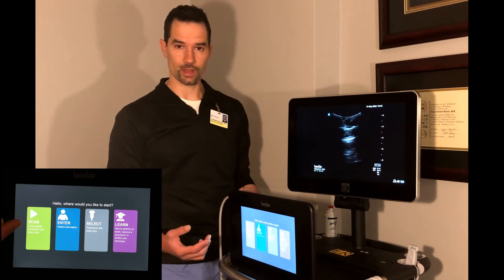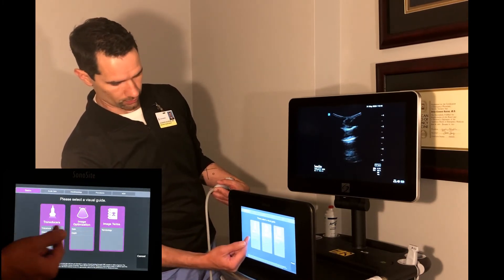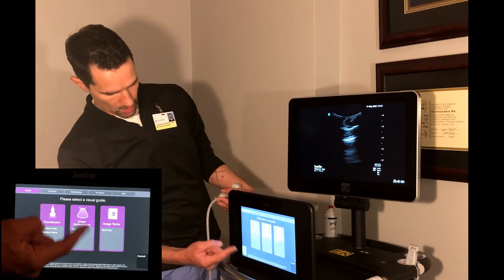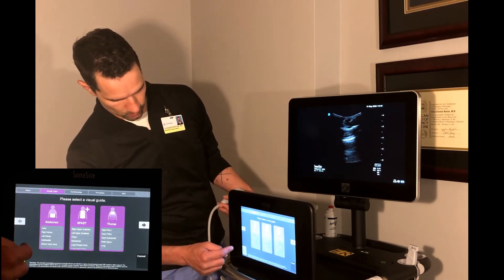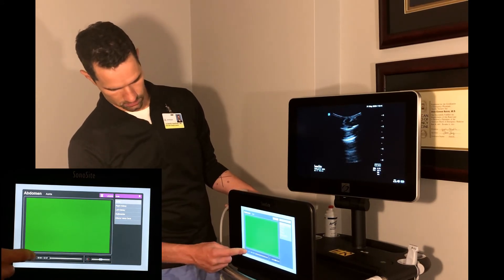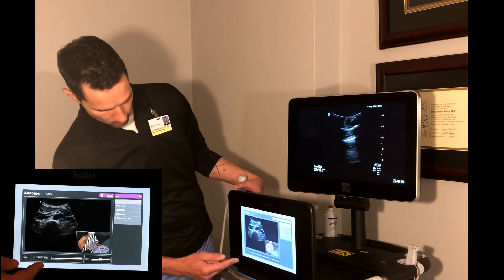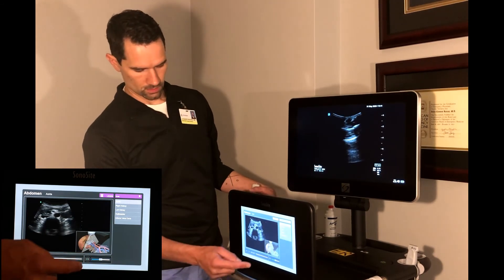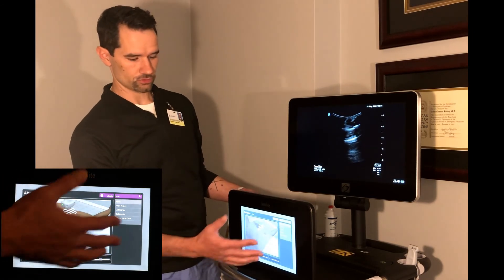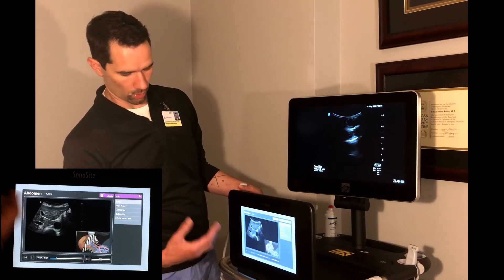If you have any interest in learning ultrasound applications, the machine has built-in learning. Hit the learn key and it will show you general information about how to use the transducers, how to optimize your image, and general ultrasound terms. For example, go into the acute care button — which is mostly what we'll be doing — and select 'Aorta' to pull up a video on how to perform an aorta ultrasound. It has picture-in-picture and audio. The nice thing is you can watch the video while performing your scan on a live patient.